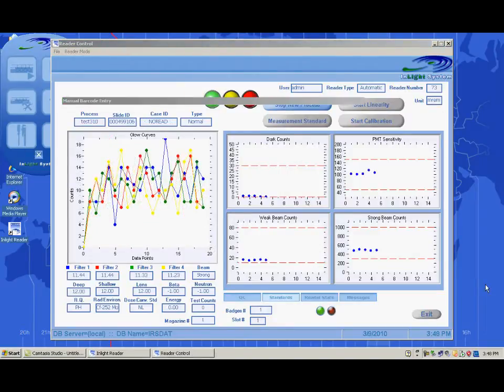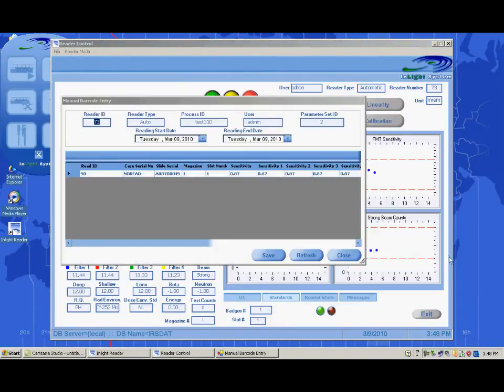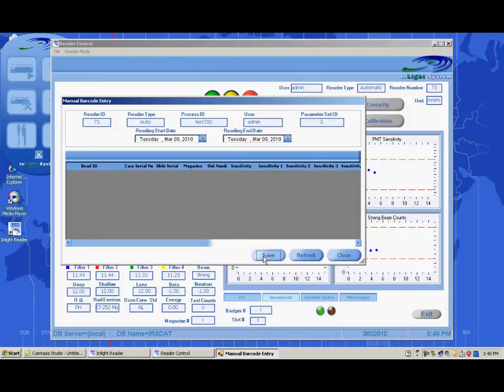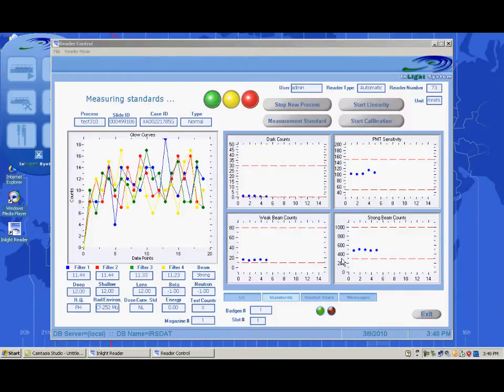If any barcodes fail to be read by the reader, a screen will appear so that the operator can manually enter in the serial numbers. Type or scan the barcode number. Click the Save and then the Close buttons. At the end of each process, another standard measurement test will be performed.